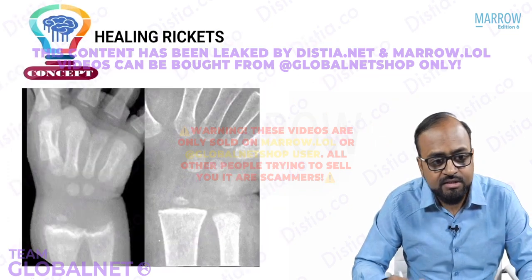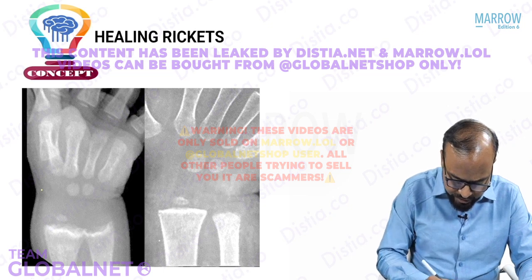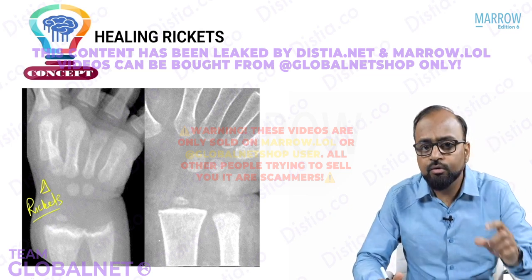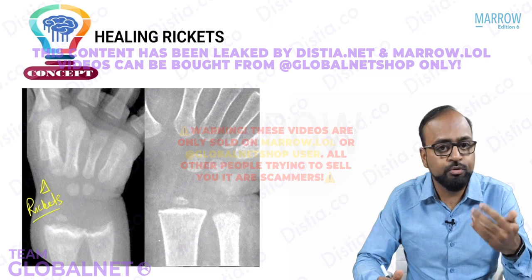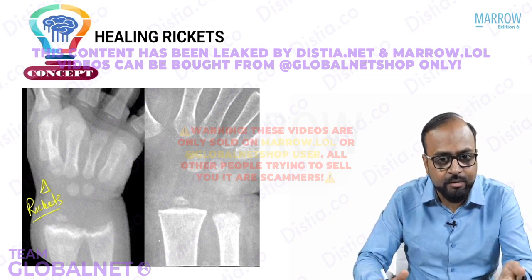Now, how do we assess healing rickets? We've seen this particular child. This was a child diagnosed with rickets. We saw widening, cupping and fraying of the metaphyseal margin. But when you treat this child, how do you treat this child? There are specific regimens. You'll study this in pediatrics. High doses of vitamin D are administered.